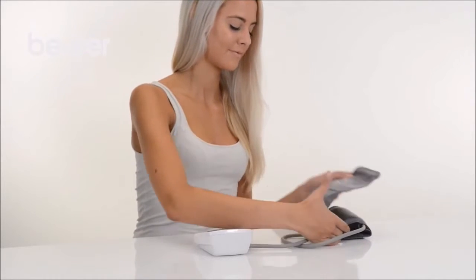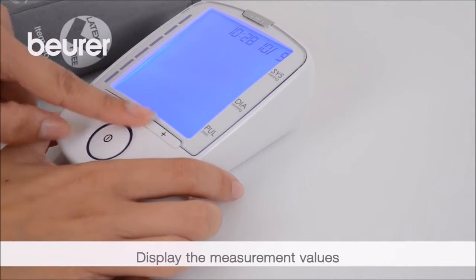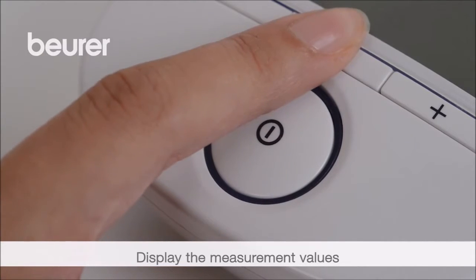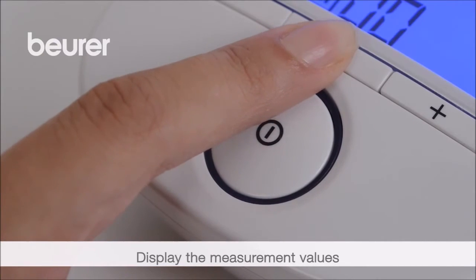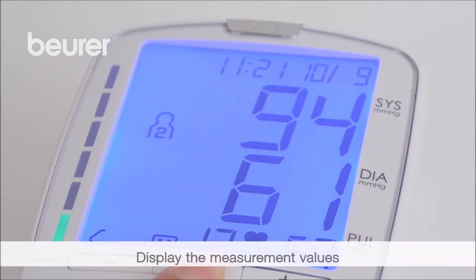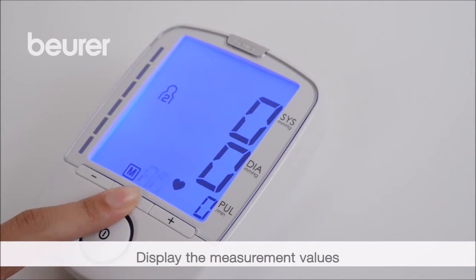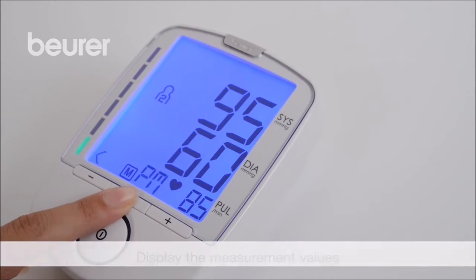Displaying and deleting measurement values. Select the user memory by pressing plus or minus. Press start/stop to confirm your selection. Then press the memory button M. The average value of all stored measurement values appears. Repeatedly pressing the M button calls up average values for morning and evening, as well as other individual values.